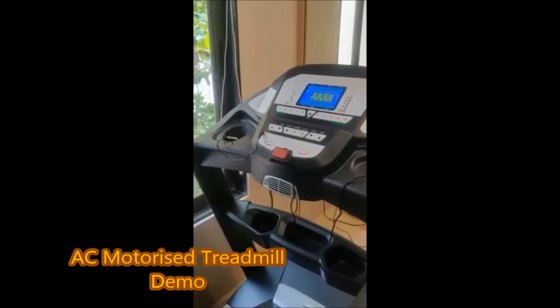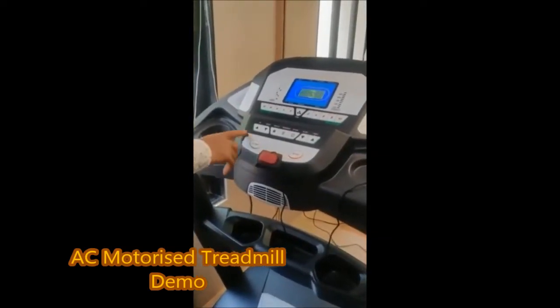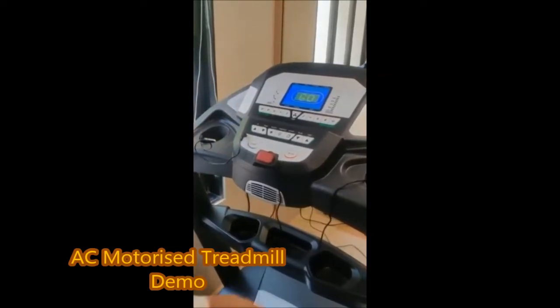After the start of the machine, the start and stop button is located here. When the start button is pressed, the machine will start after 3 seconds.